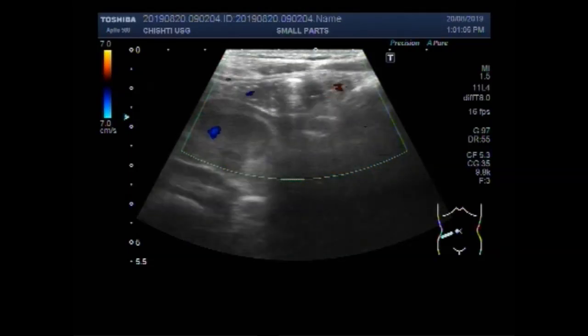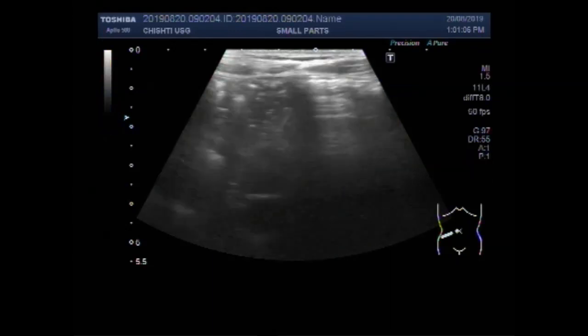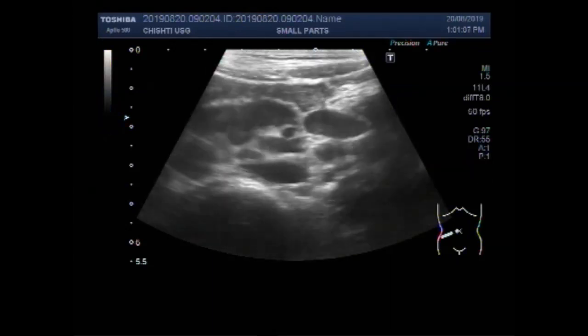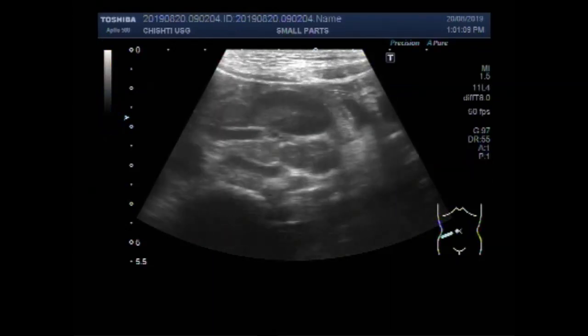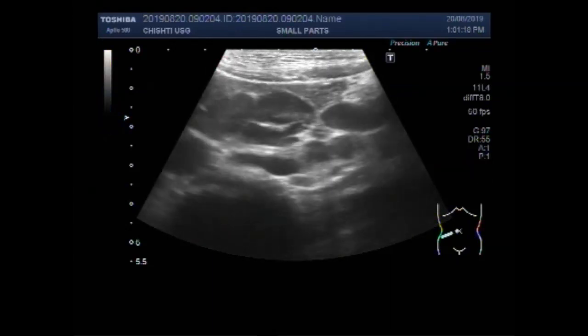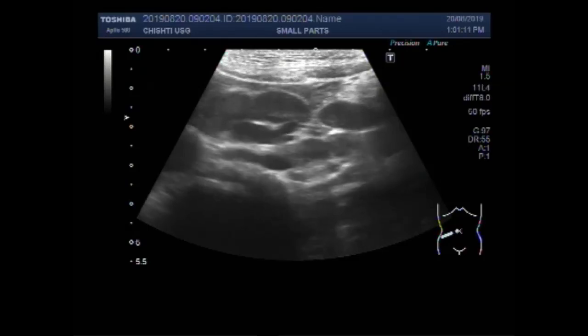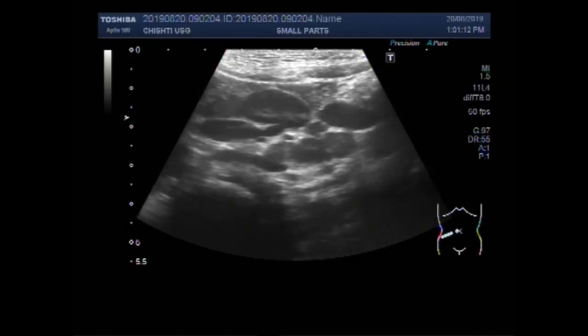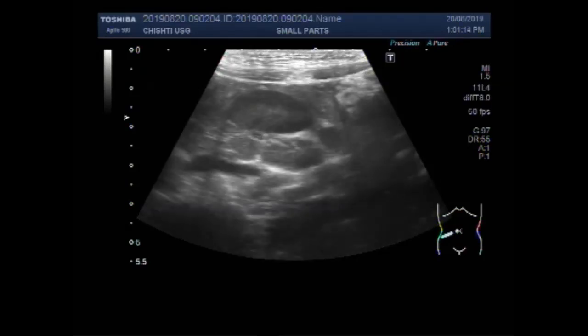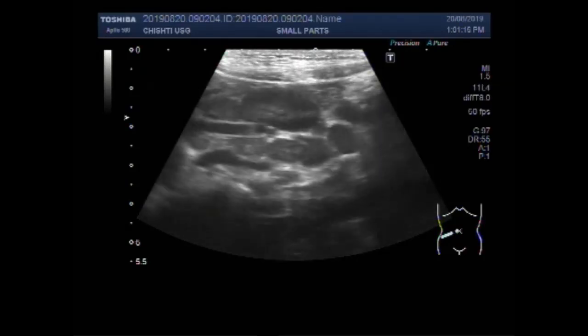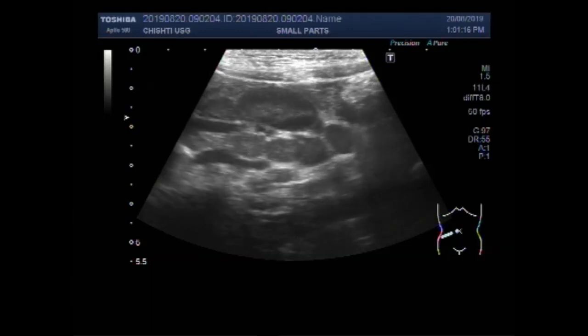Dear Waves, I hope you are all fine. This ultrasound video shows multiple enlarged lymph nodes in the abdominal cavity.